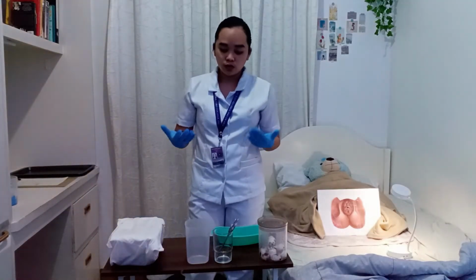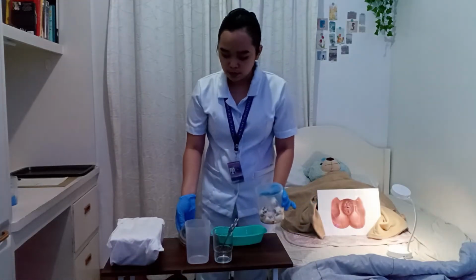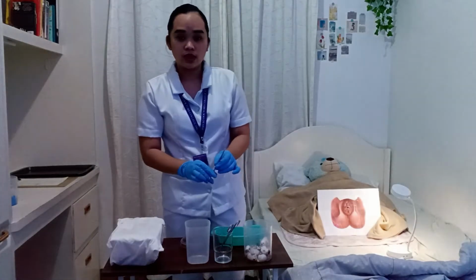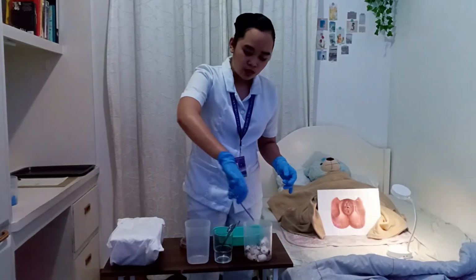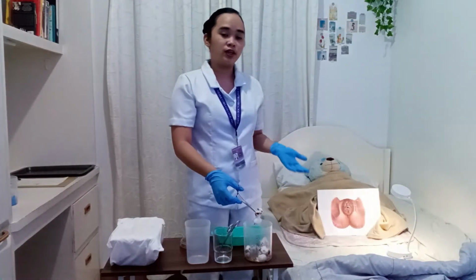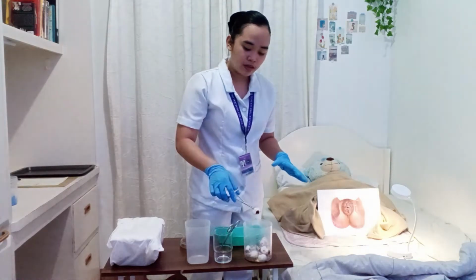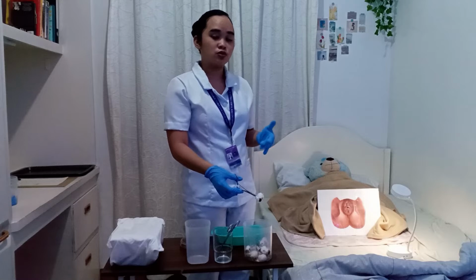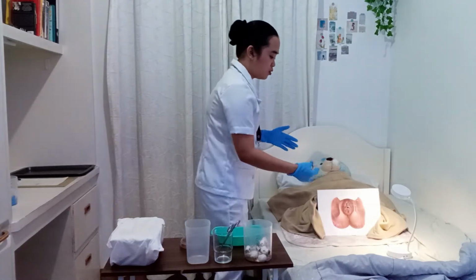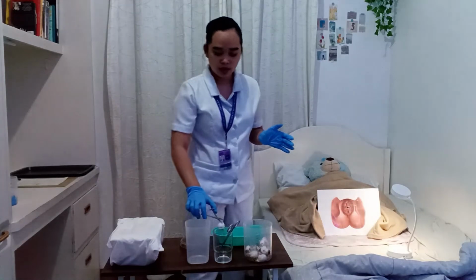Okay, so now I'm going to start cleaning at the midline of the symphysis pubis down towards the anus. So always remember to never retrace a stroke to prevent contaminating the area, and also start cleaning at the area farthest from you to avoid contaminating the rest of the area. And since I am on the right side of the patient, I'm going to start cleaning at the left side of the patient. Okay? So, from the midline of the symphysis pubis down towards the anus and then discard.